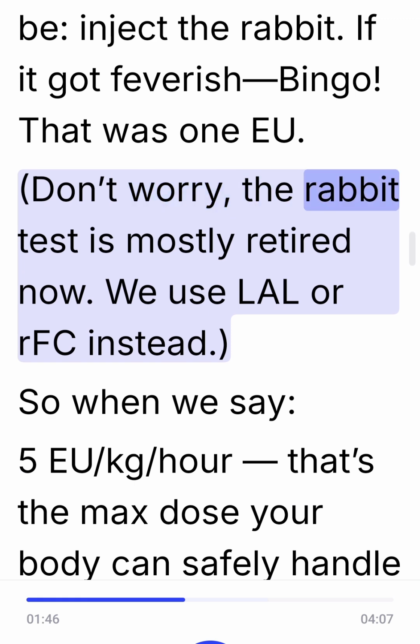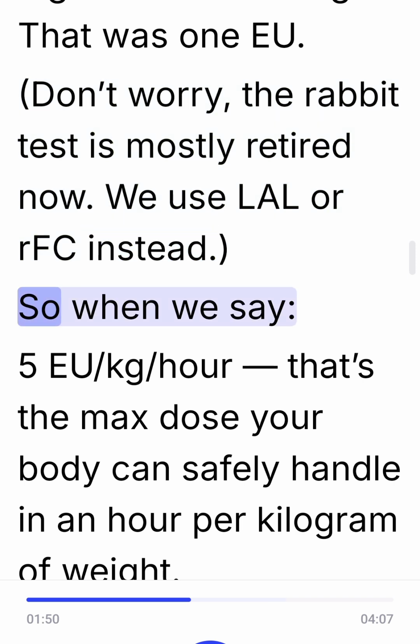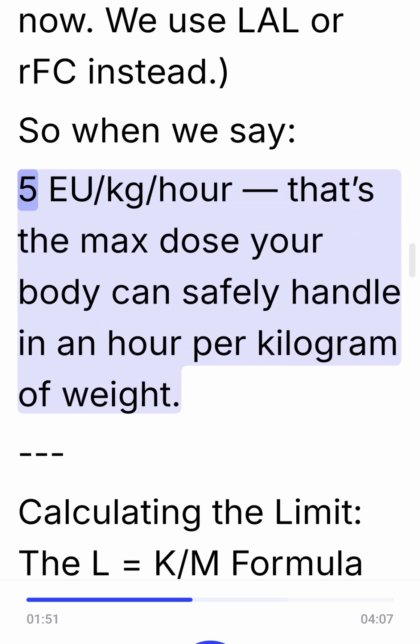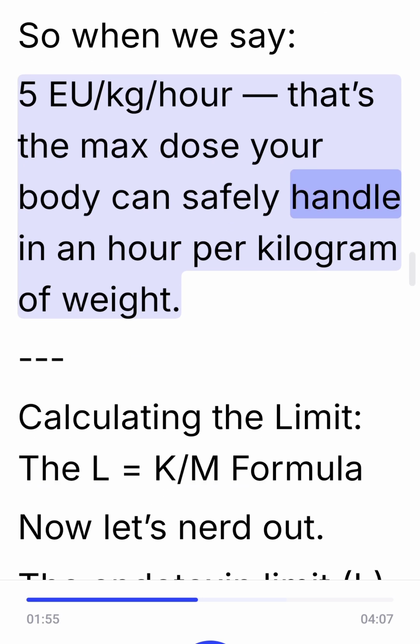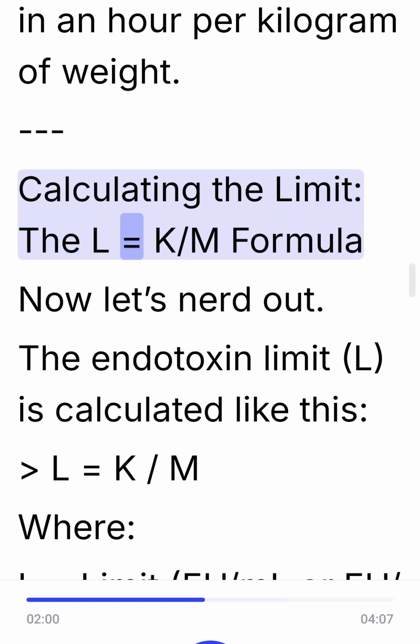Don't worry, the rabbit test is mostly retired now. We use LAL or rFC instead. So when we say 5 EU/kg/hour, that's the max dose your body can safely handle in an hour per kilogram of weight.